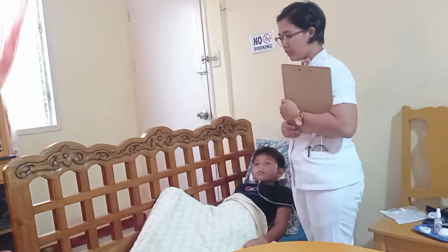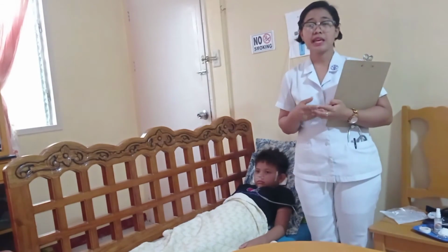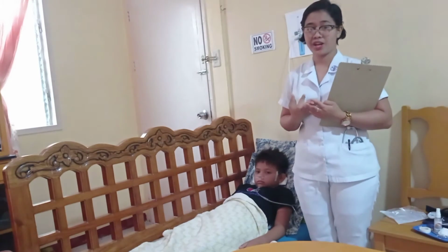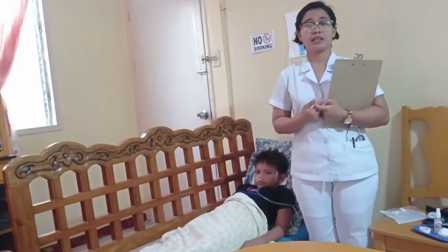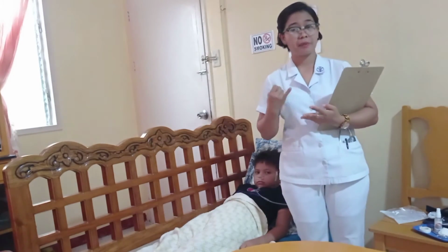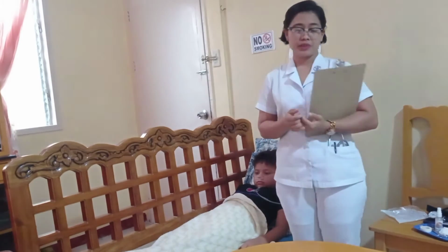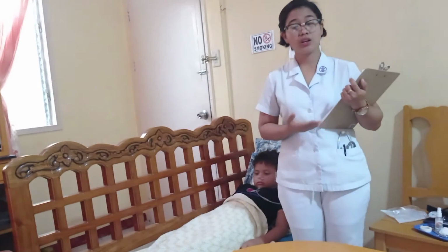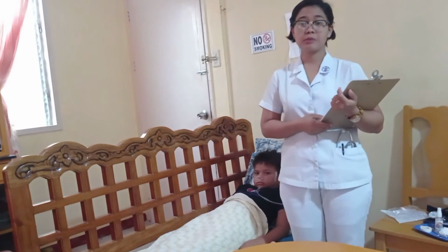Okay, thank you. This is to ensure that the therapy is well tolerated by the patient with no signs of hypoxemia or hypoxia. Then I am going to assess my clients every 15 to 30 minutes, depending on the client's situation. I will also assess the clients regularly for clinical signs of hypoxia, tachycardia, confusion, dyspnea, restlessness, and cyanosis. I am going to review the oxygen saturation or the arterial blood gas results if available.